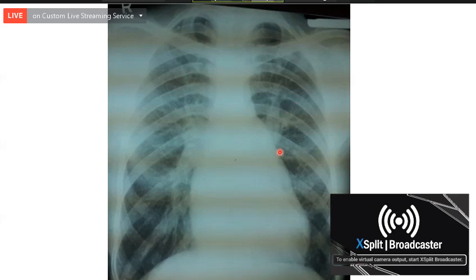What are the features of pulmonary venous hypertension on the chest X-ray? Five features. Upper lobe vein prominence. Kerley B lines. Very good. Pleural effusion. Fissure effusion? No, that is not a feature. Fissural thickening, pulmonary congestion. Sometimes you can get it. Mostly it is a feature of right heart failure.